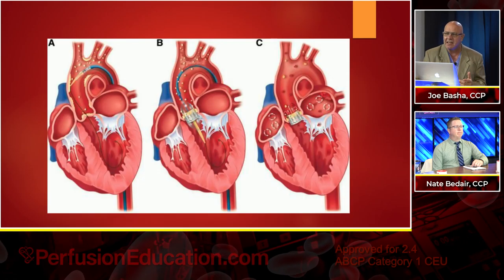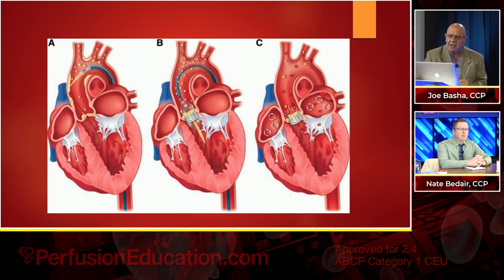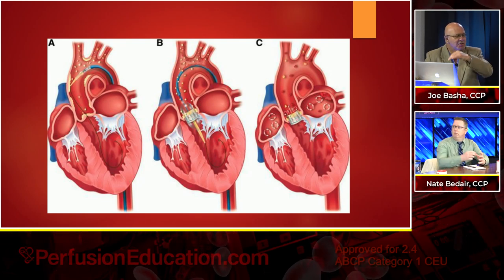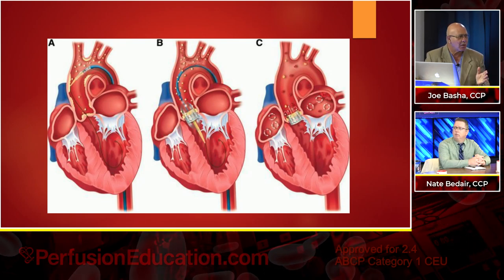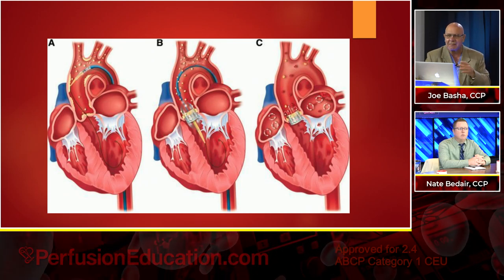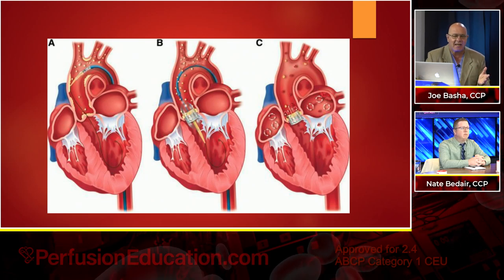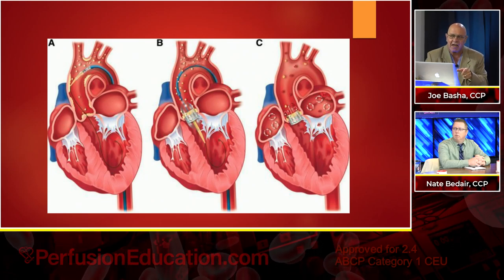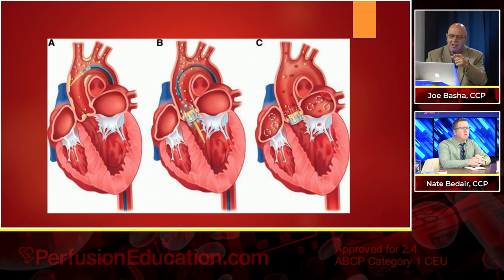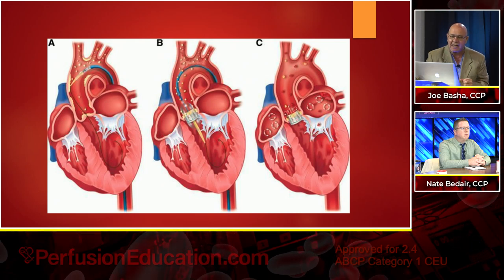Well, the reality is, as that thing is going up the aorta and starting to make that turn around the arch, it's banging against that superior wall of the aorta. And it's breaking off pieces of atheroma, calcification, tissue, whatever else is getting knocked off as it comes around. You can see it on the lateral aspect of the aorta down by the sinotubular junction. You can see it, I'm sure, right there in A.